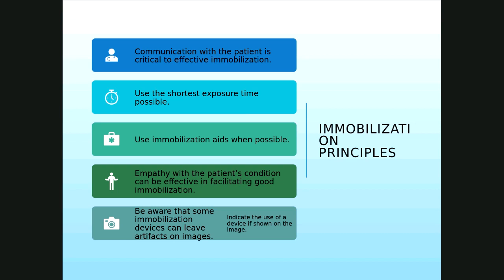So something like lead, the lead shields that we use, a sandbag that we use to help immobilize a patient, those items are radiopaque. So when items are radiopaque that we use, sometimes you can leave an artifact on the image, meaning that the radiologist will be able to tell that you used something. So you always want to indicate if you used an immobilization device so that if he or she sees something on there, they could deduce whether or not that was what it was from. Okay?